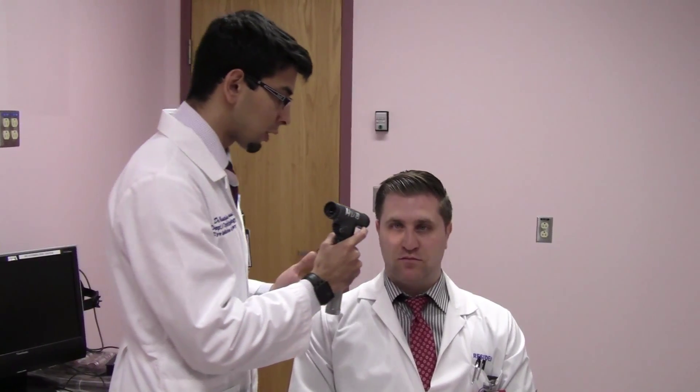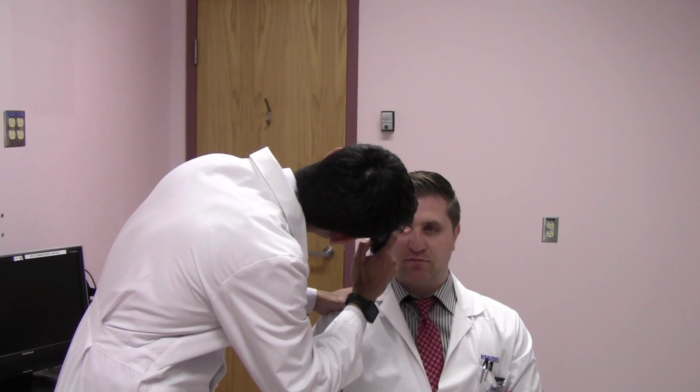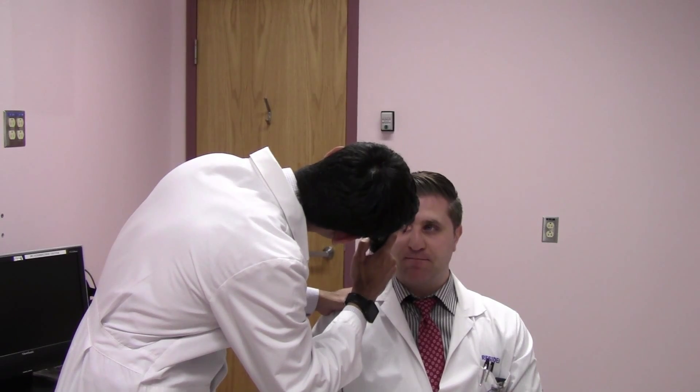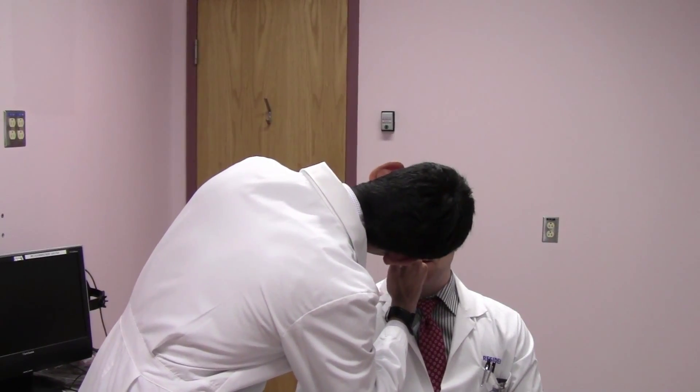To see the fovea and macula, there are two options. The easier option: ask the patient to look at the light — they will move their gaze 15 degrees right into the light of the ophthalmoscope and you'll be able to visualize the fovea right away. The other option is to rotate yourself 15 degrees to look right into the fovea. Here, I can see the patient's red reflex. I'm keeping my hand on their shoulder, about 15 degrees away, following that red reflex right in — and right about here, I can see the patient's disc. Would you mind looking directly at the light, please? You can see his gaze shifted 15 degrees and I can see his fovea. Or, looking straight ahead, I can rotate myself to see his fovea. With a dilated patient, I can also move down, up, left, and right to see different parts of the retina, giving a nice 30-degree posterior segment examination. And that's all there is to it.